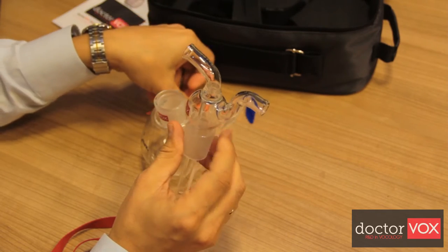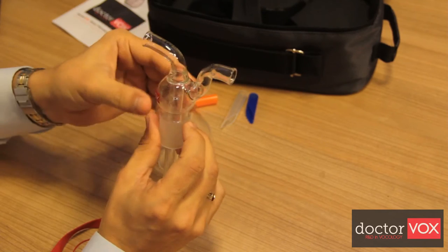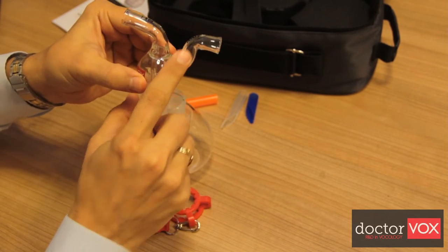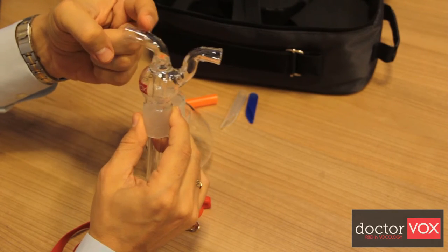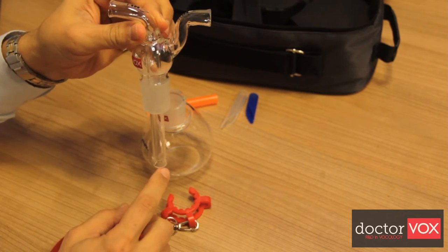There are two tube openings on the top. The swan neck-like tube indicates the breathing outlet from the container. The phonation inlet is the opening of the inner tube from which the user can blow voice into water.